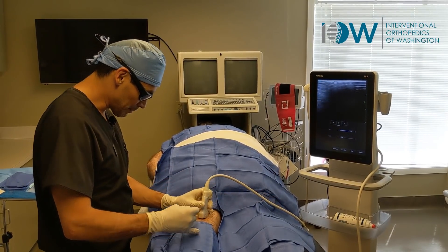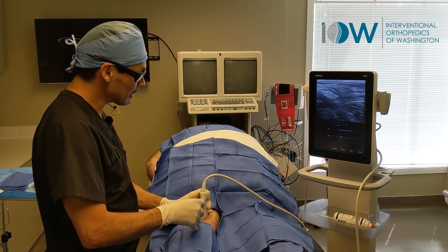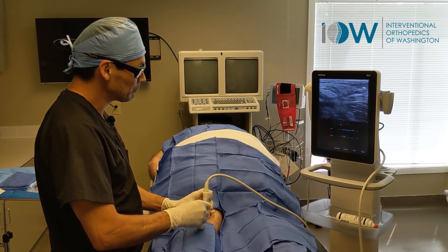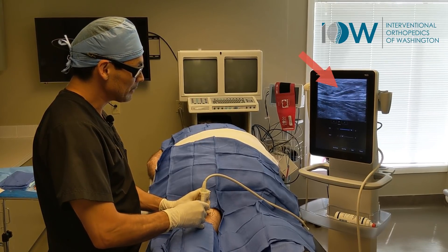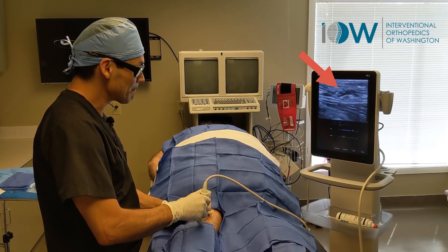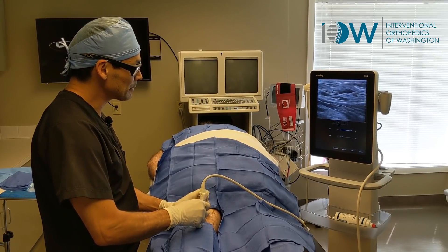So I want to strengthen that capsule with some prolotherapy, so we're going to take it right along the area where that Baker's cyst was at. And you can see it kind of filling up — this time filling up with good stuff. And there's the capsule; we're going to strengthen that capsule.